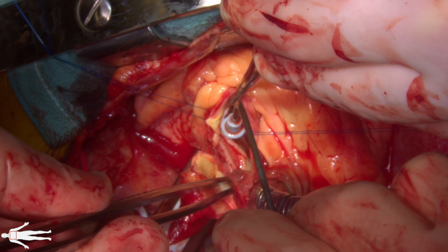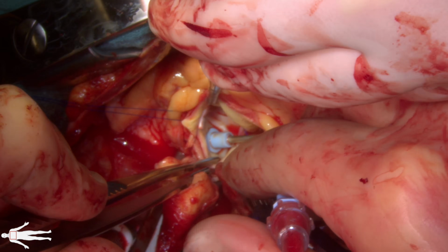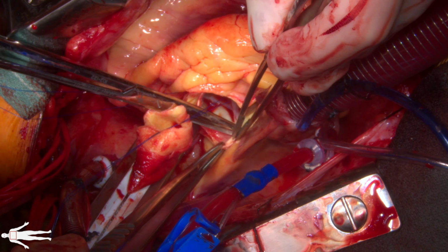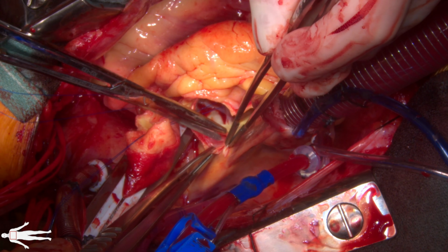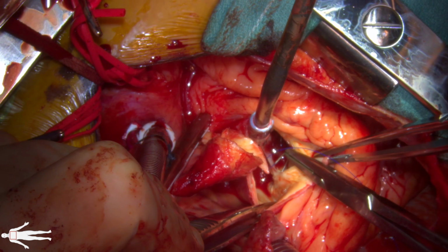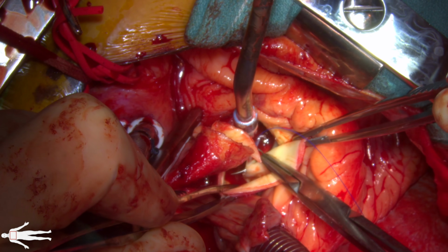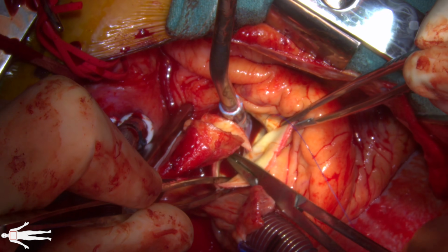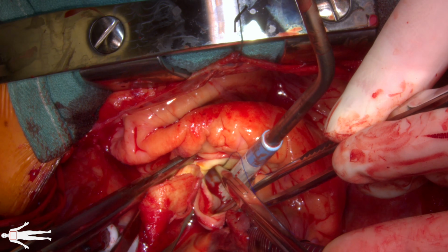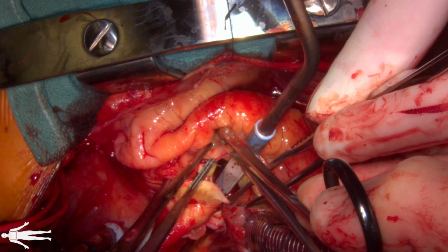The left and right coronary ostia were visualized, and del Nido cardioplegia was directly administered. An intimal tear is noted in the posterior aspect of the ascending aorta just above the sinotubular junction. The coronary ostia are noted to be intact. Given that the coronary ostia were intact and the aortic valve was noted to be trileaflet, free of calcification and with good coaptation, the decision was made to pursue valve resuspension.